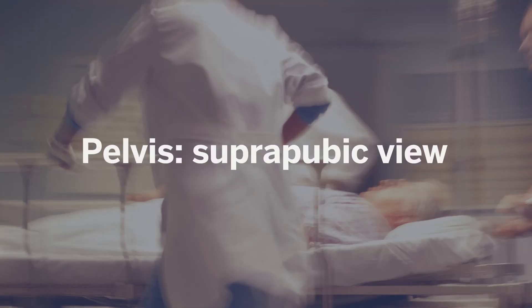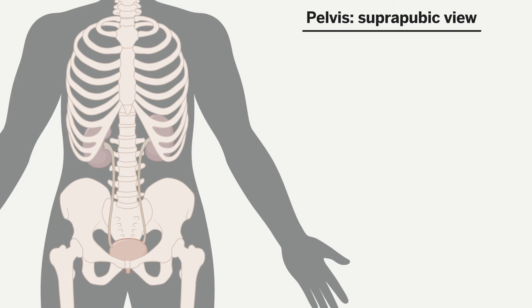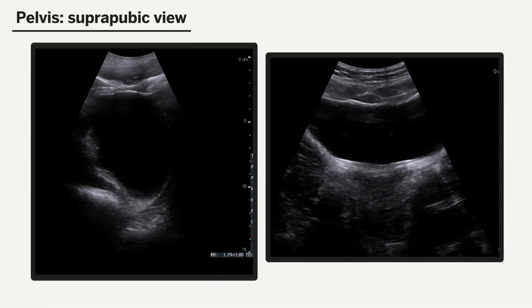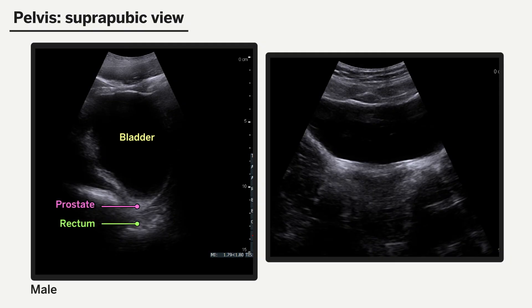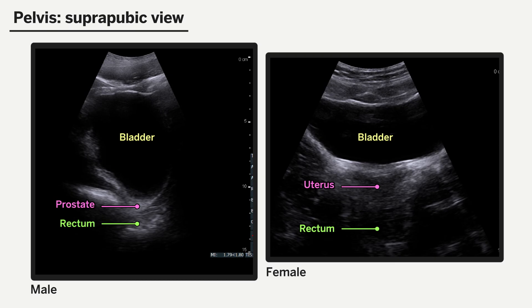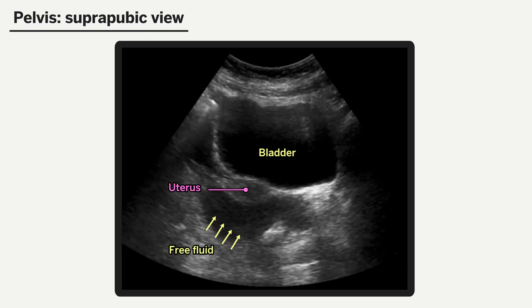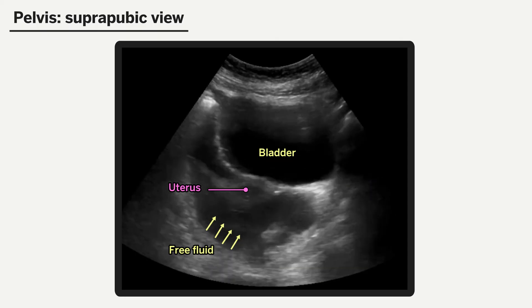Finally, the pelvic scan will assess for fluid in the suprapubic region. To obtain this view, we place the probe right above the pubic symphysis with the indicator facing to the patient's right. Ideally, the patient would have a full bladder to act as an acoustic window, and the probe should be tilted caudally to scan deep into the pelvic cavity. In this view, we should be able to identify the bladder, prostate, and rectum in males; and in females, the bladder, uterus, and rectum. In males, fluid tends to accumulate in the rectovesical pouch, whereas in females, fluid collects in the rectouterine pouch, also known as the pouch of Douglas. In this example, we can see free fluid accumulating in the rectouterine pouch as indicated by the yellow arrows, possibly indicating a ruptured ectopic pregnancy in this patient.